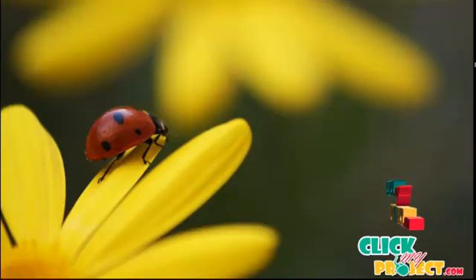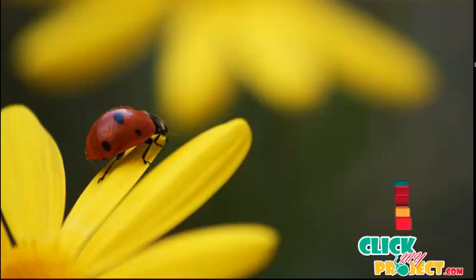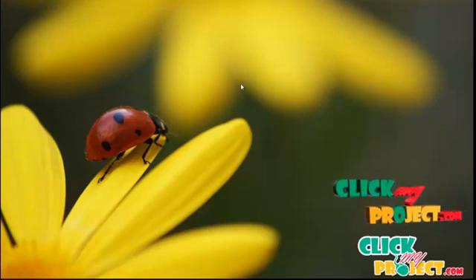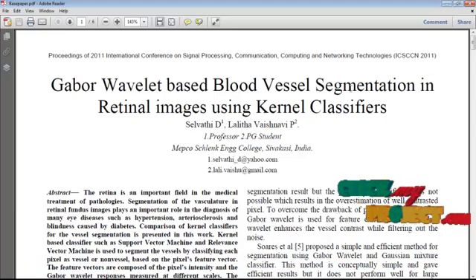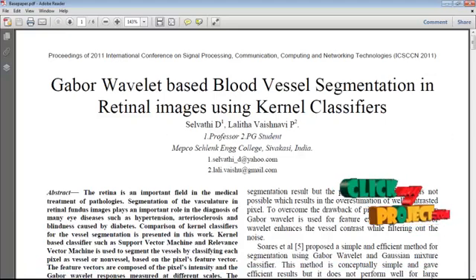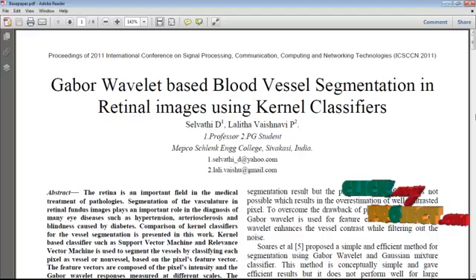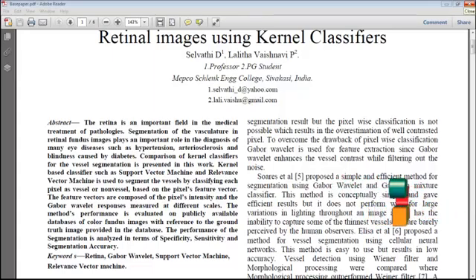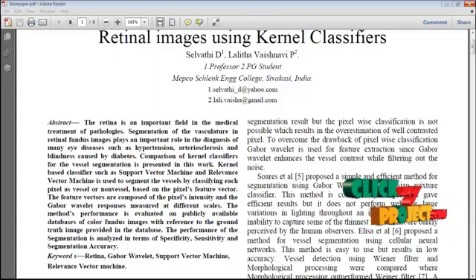Welcome to clickmyproject.com. This video demonstrates a blood vessel extraction technique in retinal images titled 'GABOR Wavelet Based Blood Vessel Segmentation in Retinal Images Using Kernel Classifiers.' The retina is an important field in the medical treatment of pathologies, and segmentation of the vasculature in retinal fundus images plays an important role.